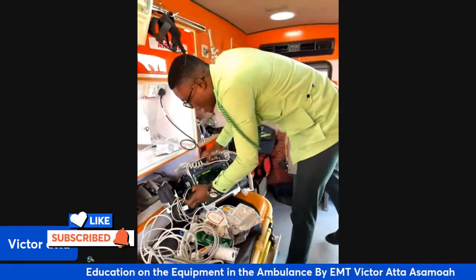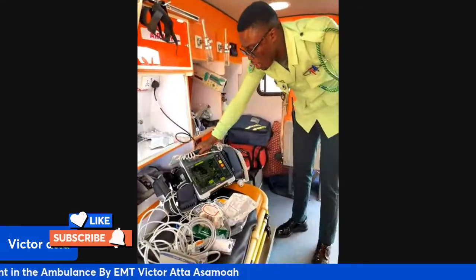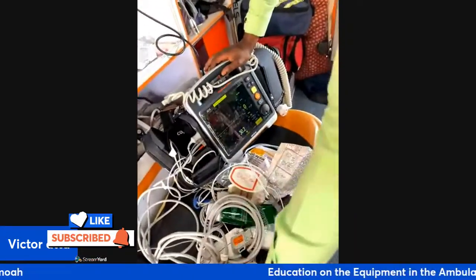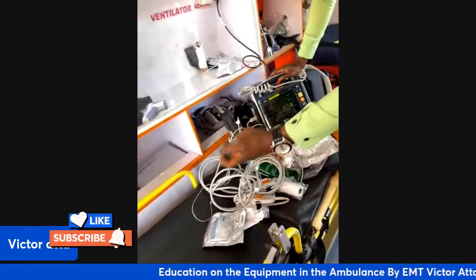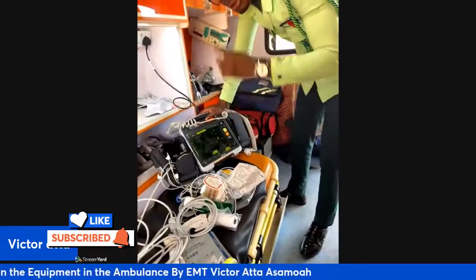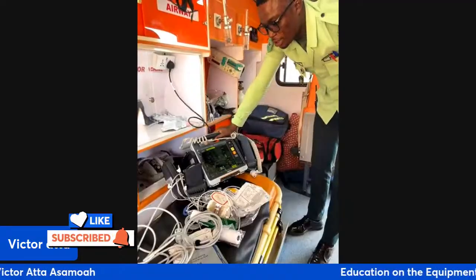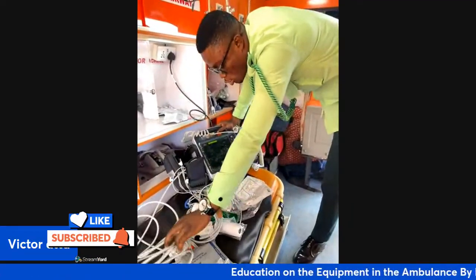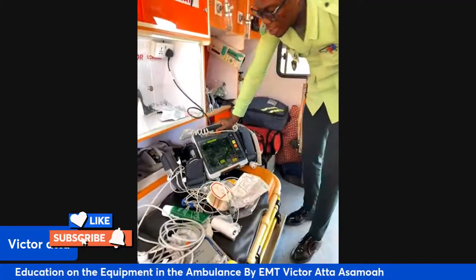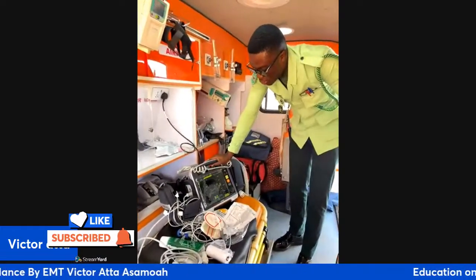So we know the vital signs, their normal ranges and everything. So when you apply the adult BP cuff on your patient, you should know the normal ranges of the BP. And then when you are using the pulse oximeter, you need to know that when your patient is going off, you know the kind of percentage the SpO2 or the oxygen saturation in your patient when the patient is going off or not.